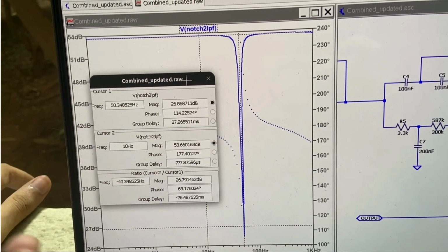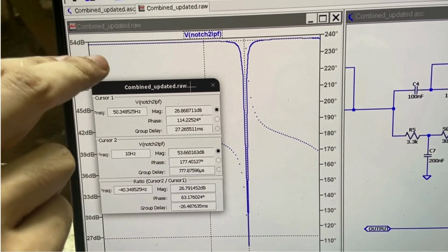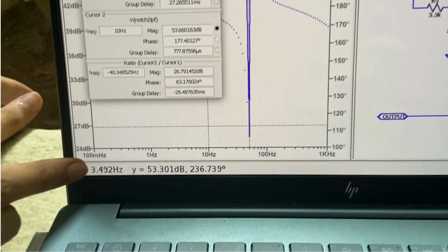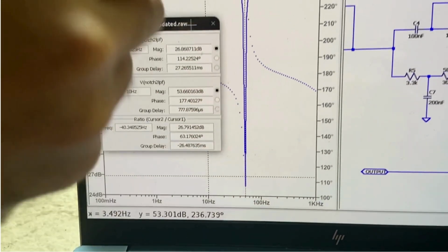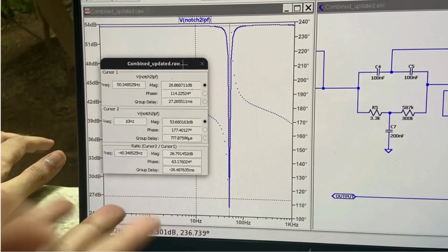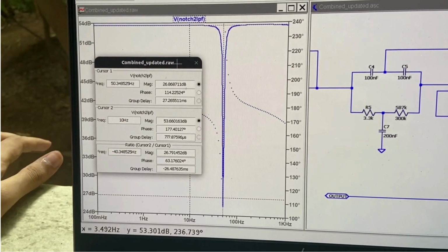Since the previous stage before this had a gain of 54, it is showing here as 54, and the notch here drops off to almost 24 decibels. It is actually an infinite notch, but since we are limited by the simulations, it shows somewhere around 24, but you can see the notch very clearly.